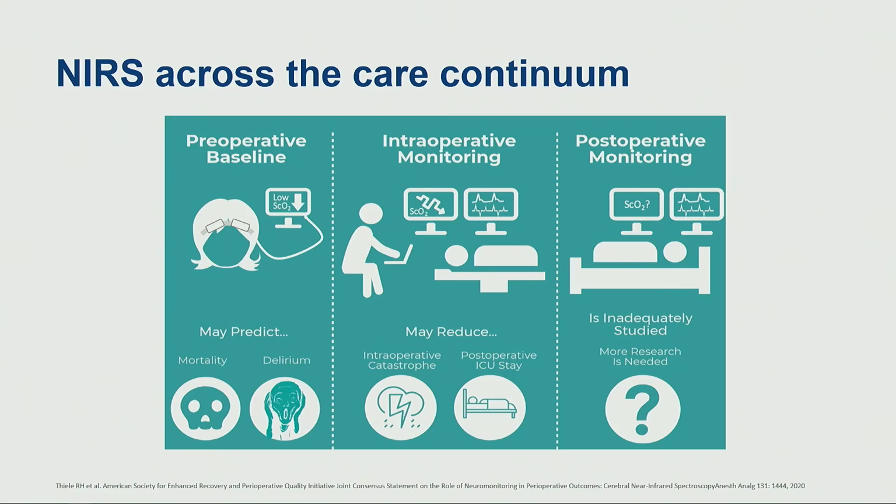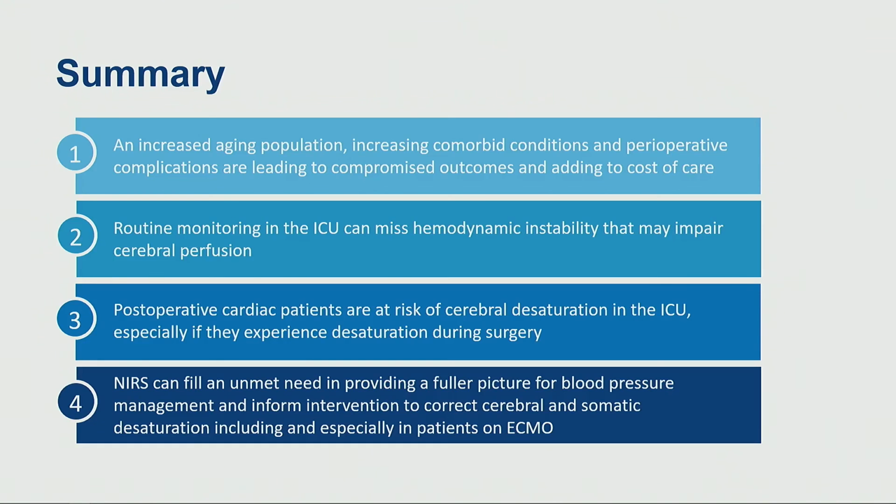Anyway, coming to the end of this, we've talked about NIRS across the care continuum. As I said, we can start NIRS in the preoperative area. We can look at it in the intraoperative period, and then in the postoperative space. There are unanswered questions. There are areas we need to work on. But I will still say that the technology is non-invasive, easy to use, gets you an extra data point, and allows you to monitor the local oxygenation at the level of the brain more effectively.